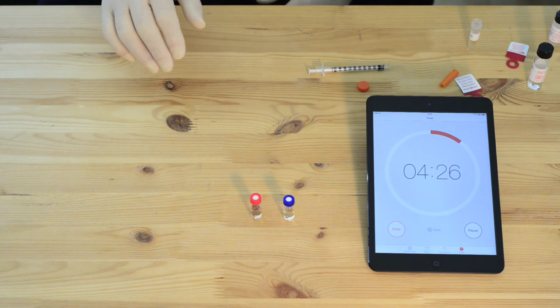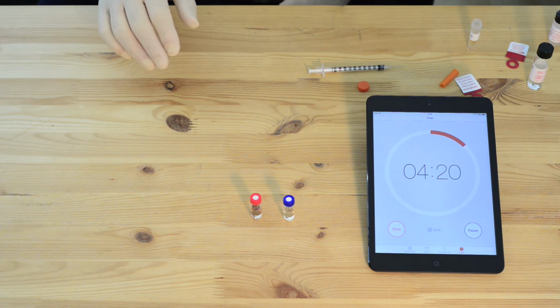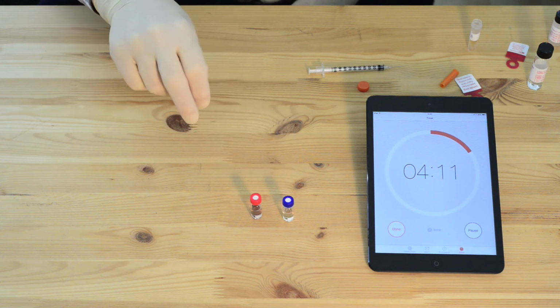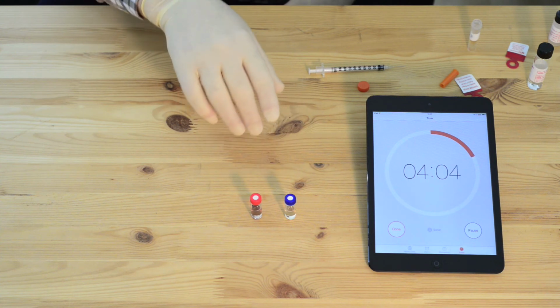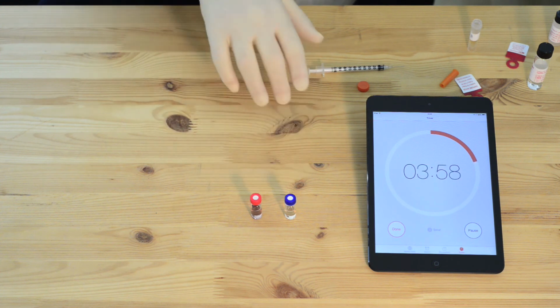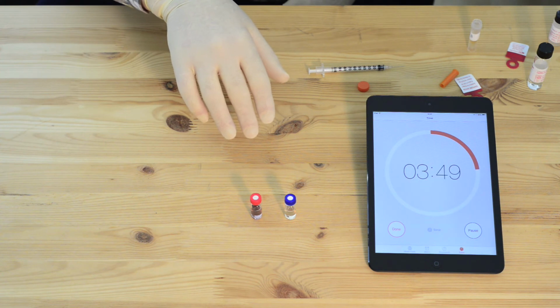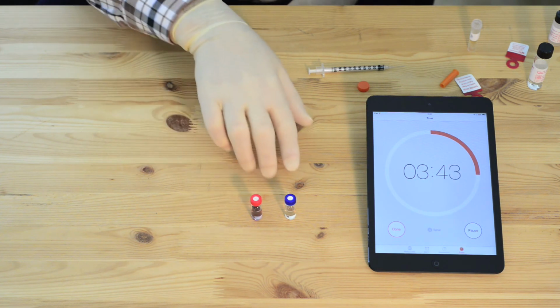These can be set aside for 5 minutes and read at exactly 5 minutes, or they can be watched during the process. The reference vial, which contains 20 milligrams per deciliter, has just enough ethylene glycol to create a reaction. It is also the cutoff level for the cat. However, it is only used in this test as a reference to eliminate any background interferences that may be in the sample. As you can see, the sample vial is quickly turning purple.